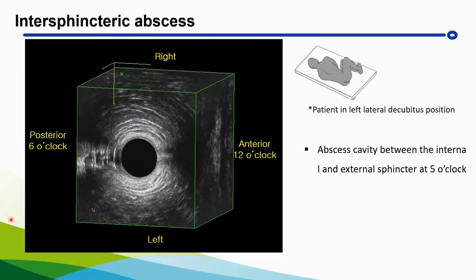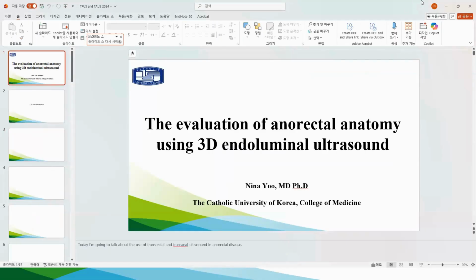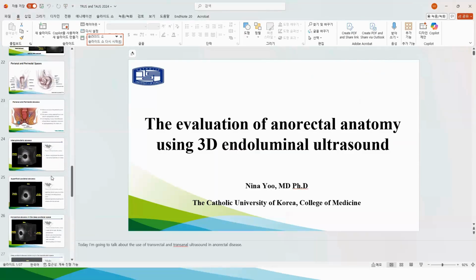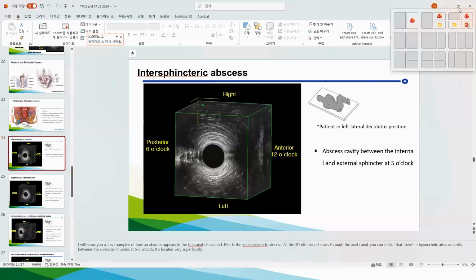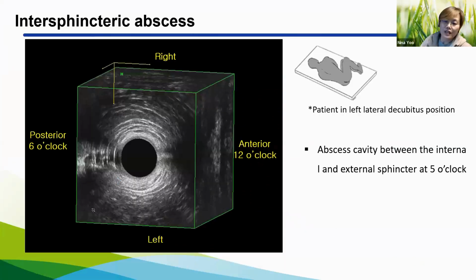The question I wanted to ask is, what are the specs for the ultrasound scan that can do this? Is there a specific model that we should look at? And I'm sure people will be interested in that. And secondly, what's the learning curve like to be able to do it? Especially if you consider a trainee who has never handled an ultrasound probe before and wants to start doing this, how many cases does that person need to do to be confident to give some form of interpretation of the images? Well, it doesn't take that many cases.